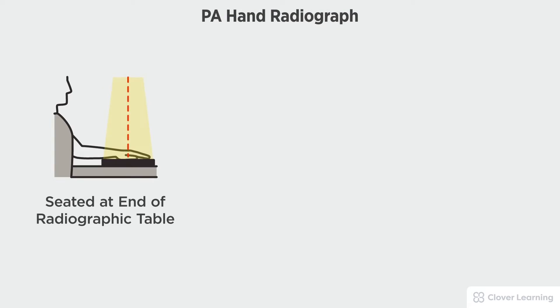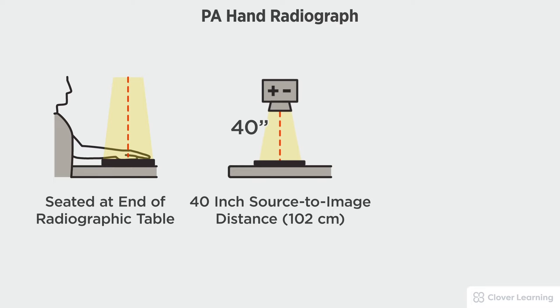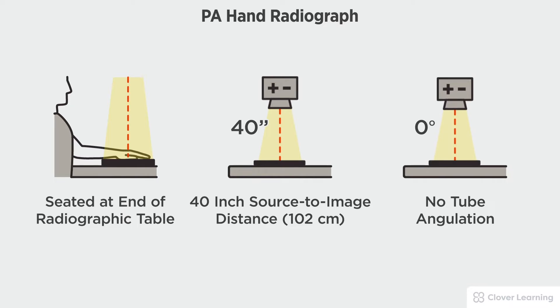In this view we will be demonstrating the PA hand. The PA hand should be performed with the patient seated at the end of the radiographic table with the image receptor placed tabletop with a 40 inch source to image distance and no tube angulation.